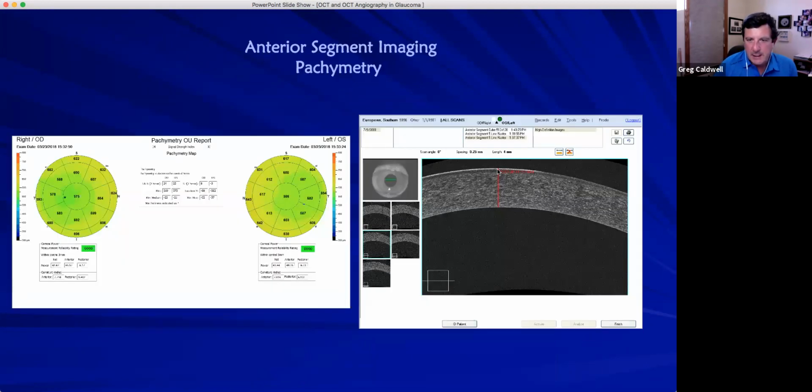But you can see here that you're actually able to see the epithelium, some of the tear film, endothelium here, able to get truly perpendicular, where if you're trying to get this ultrasonic probe perfectly perpendicular, just imagine this line right here, just off just a degree or two. It's going to cut a little bit longer, and you're going to get a little bit thicker of a pachymetry. So I truly like using my OCT to get that true cornea measurement out there.